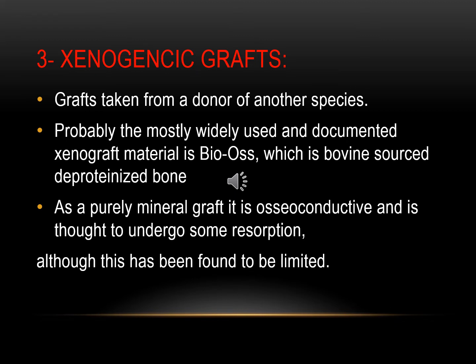That means this bone graft is harvested from cows after removal of the proteins of this bone. That means this bone graft is minerals alone without proteins. Because this graft is purely mineral graft, it will be osteoconductive.